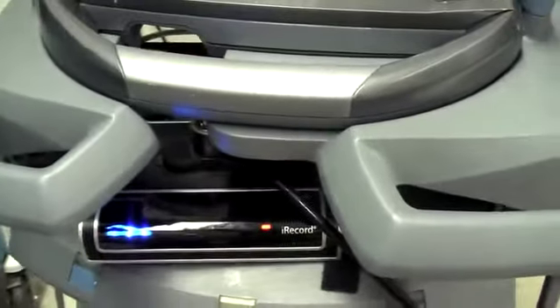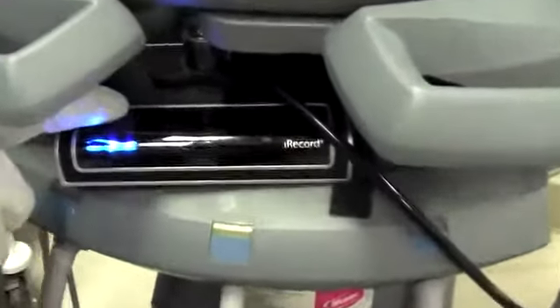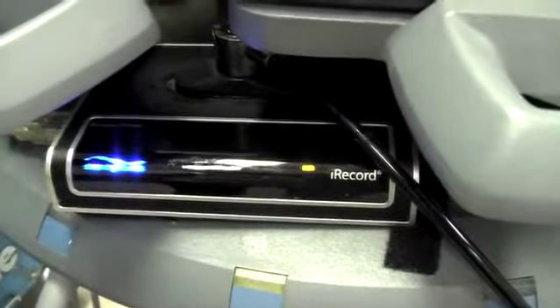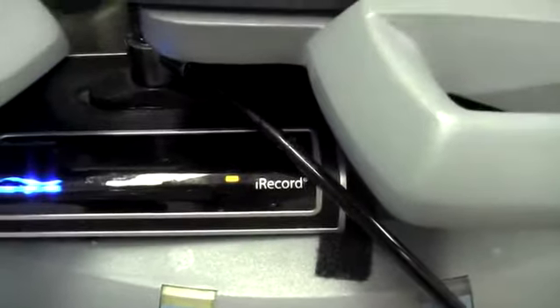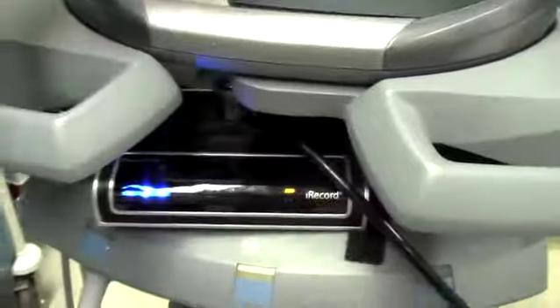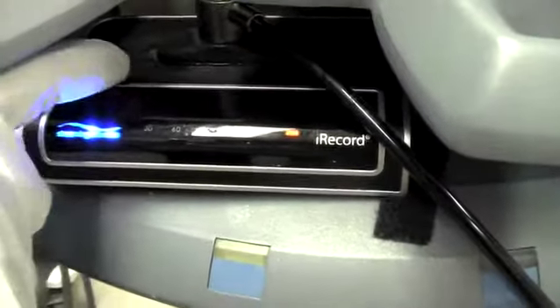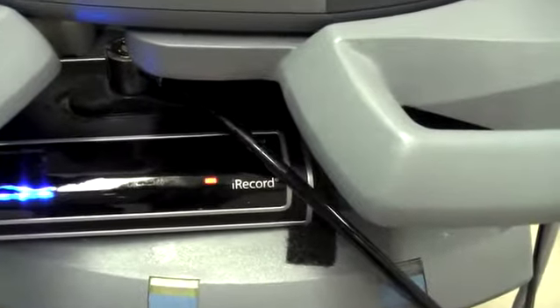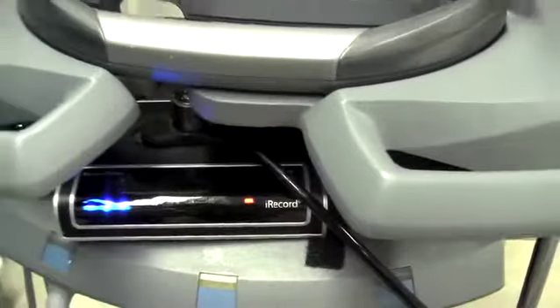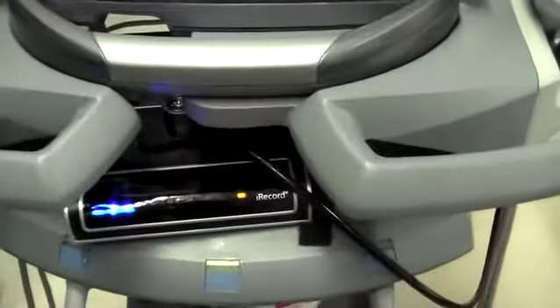If at any point you want to pause what you're recording, you hit the power button briefly, and the light will turn to flashing green alternating with flashing red. At that point it's not being recorded to the iRecord. If you want to resume recording, you hit the power button again, and it goes back to flashing red. If at any point you want to stop the recording completely, you hit this record button, and it goes back to its ready state, which is solid green.